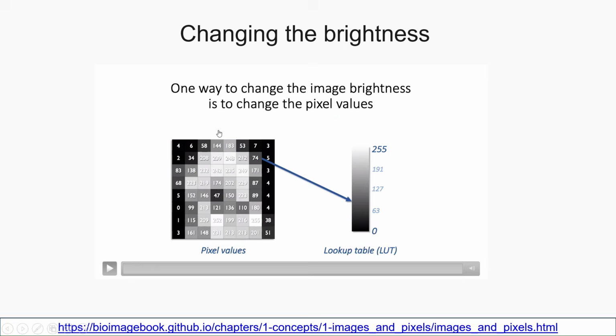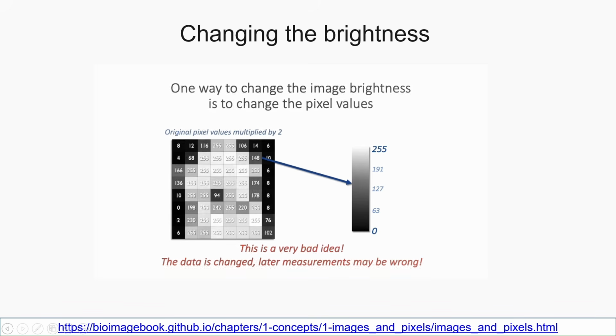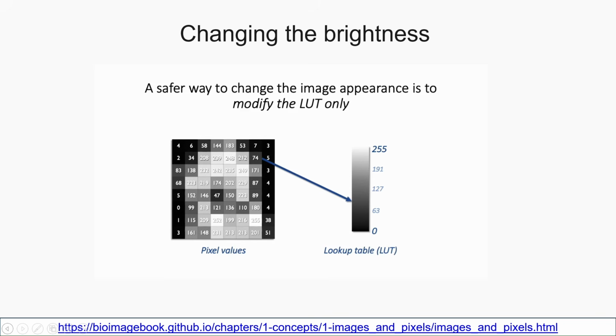Before discussing color, let's revisit brightness adjustments. As we learned previously, changing brightness and contrast affects how pixel values are displayed, but does not necessarily alter the underlying image data. This distinction is important because many visualization tools modify appearance without changing the actual measurements. When interpreting fluorescence images, we need to be aware of whether we are viewing raw data or simply adjusting how that data are presented. Brightness, contrast, and color mapping are all examples of display operations that can dramatically alter appearance while leaving pixel values unchanged.